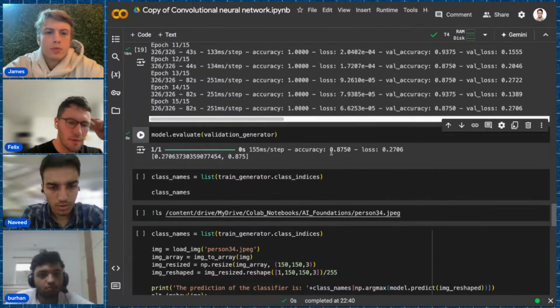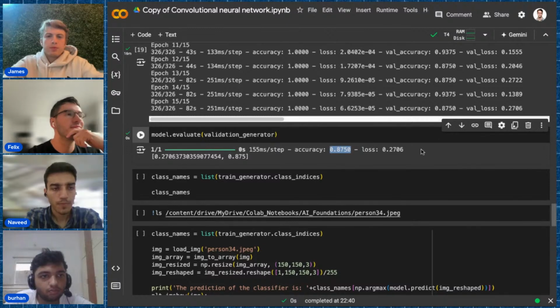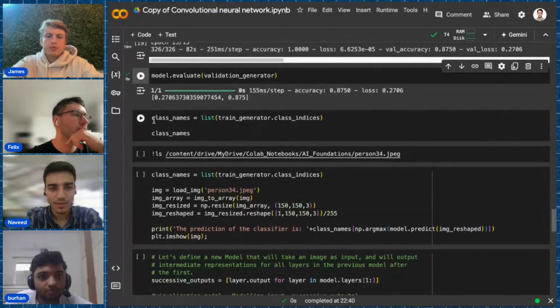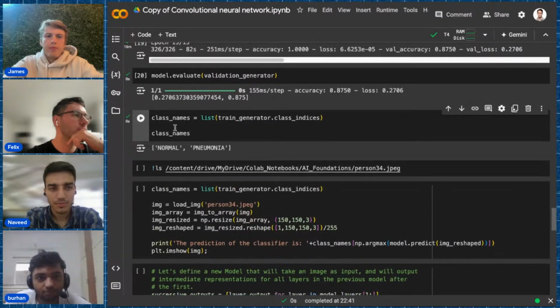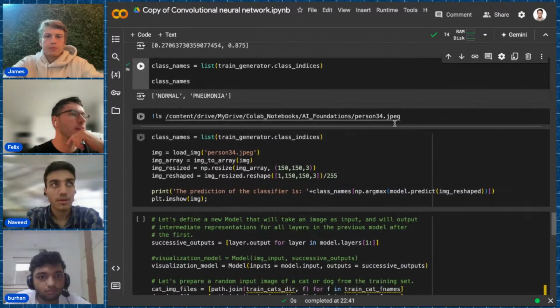How much did you have here, Burhan, in the validation set accuracy? I had 98%. Nice. Interesting. Okay, all right, so that makes sense.